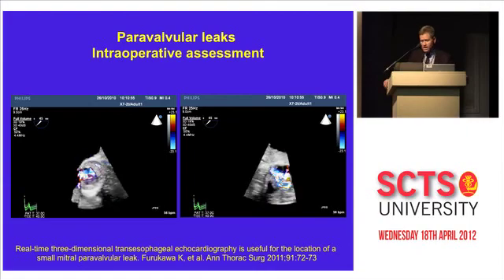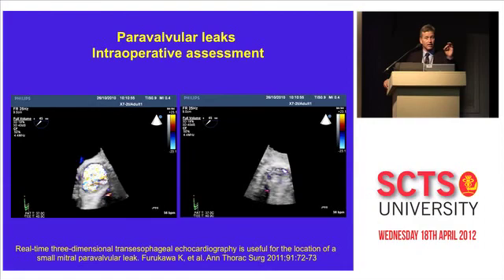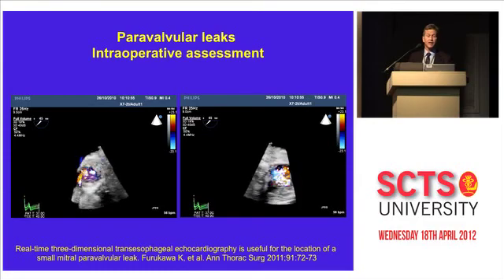And in this specific case, the surgeon said it was a very calcified annulus, and it took quite a while to remove all the calcium. You can understand that. Not all patients are the same, and the tissue quality varies.